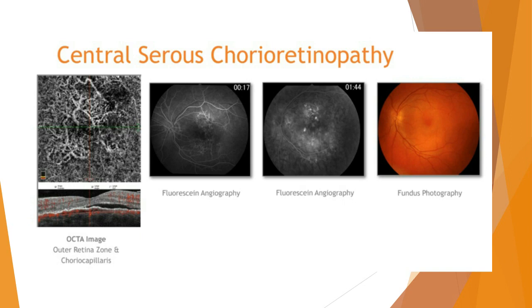The fluorescein angiograms, again, are not going to image occult membranes very well, so they're not very helpful in this patient or in this situation. But look how beautifully the angiogram is picking up this kind of burnt out old filamentary lesion that has probably been there for quite a while. So we don't ever want to ignore patients that have had CSR for a long time, because they do have the propensity to develop these occult membranes.